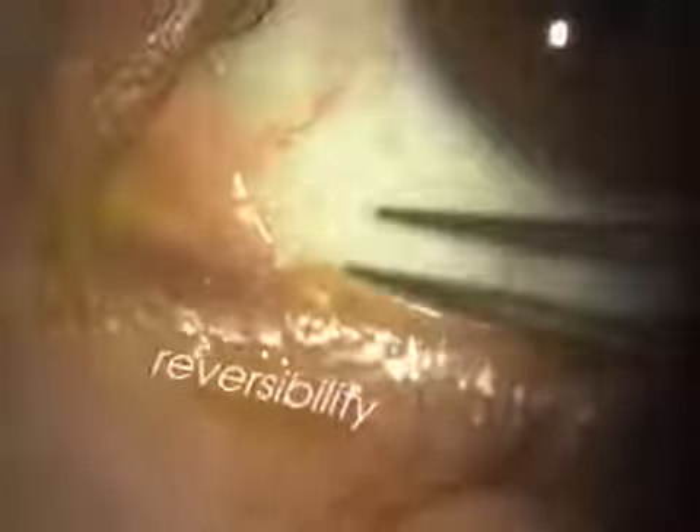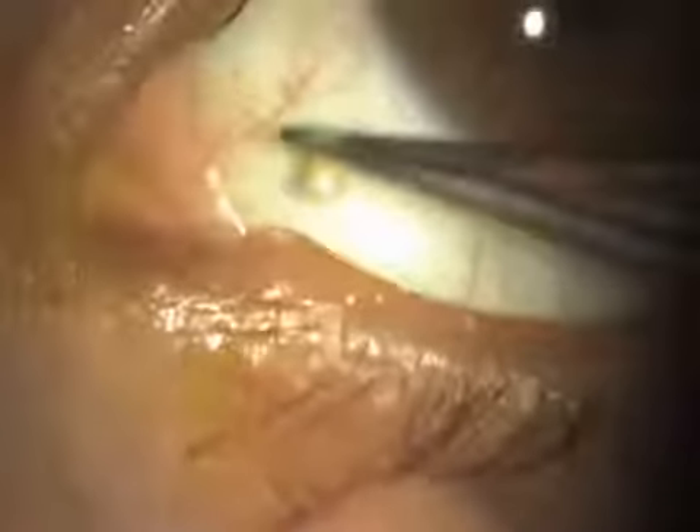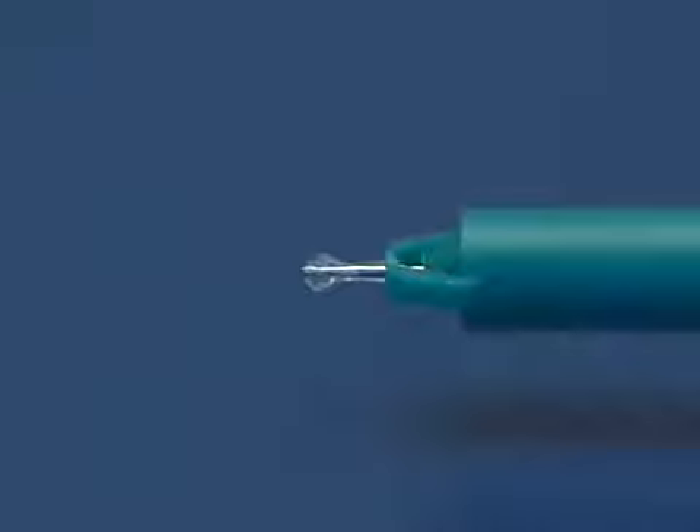The painless plug is very easy to remove using forceps. Since the plug comes in one size only, the practitioner does not have to worry about finding the right plug size for the punctum.